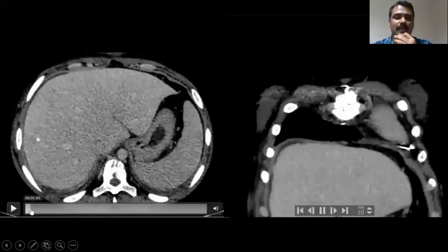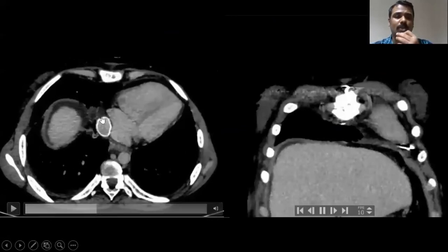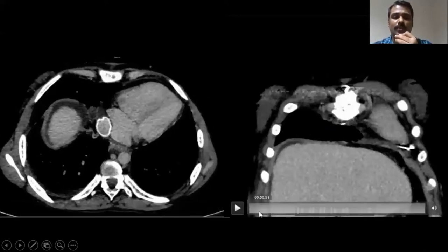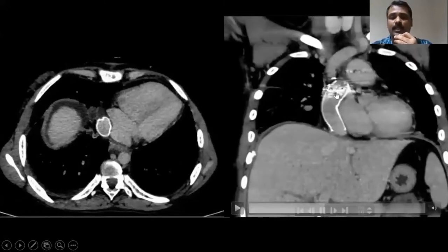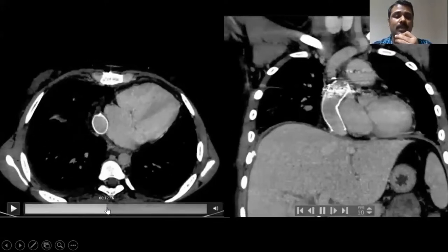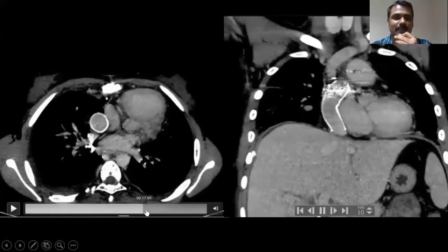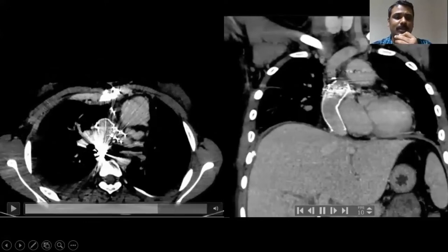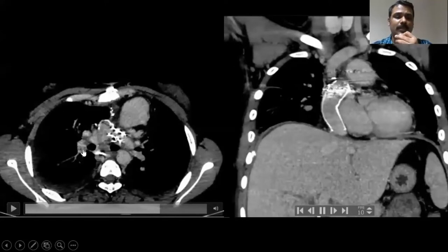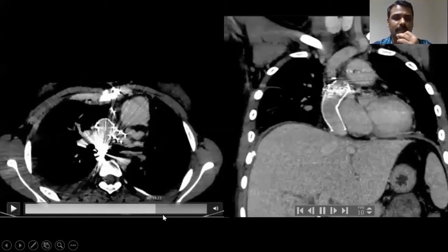These are the axial and coronal sections of cardiac CT in venous phase, showing the hepatic veins and IVC with good contrast opacification. As we go superiorly, we find a hyperdense bordered structure — the conduit connecting IVC to the pulmonary circulation. There is no kink or thrombosis within the circuit, and there are few artifacts due to previous MAPCA coiling and the LPA stent. We can also identify a fenestration as a focal defect within the conduit connecting to the atrial chamber. Further superiorly, we see patency of the right and left pulmonary arteries with patent branches. There is also mild dilatation of the ascending aorta, and proximal coronary arteries are normal.